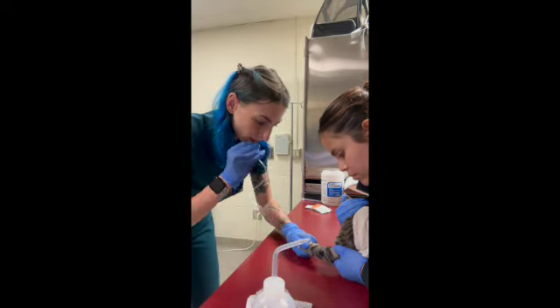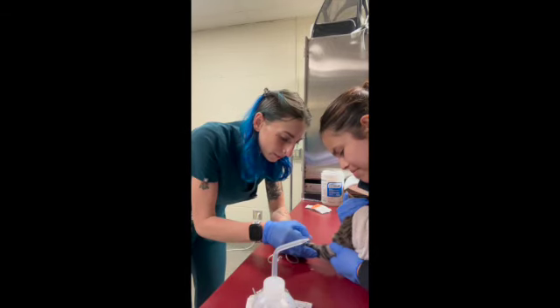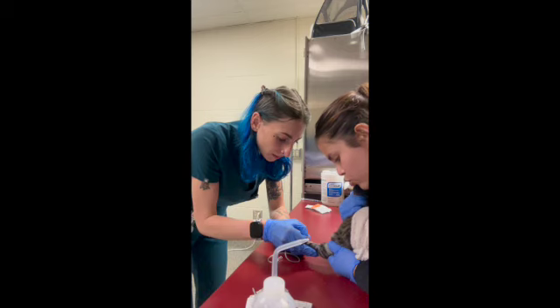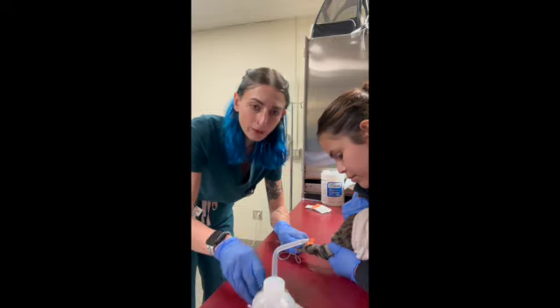Please let me get this on the first try. Probably should not have taken that out with my mouth either. All right. And now we're going to poke. Alright, so there's blood in our line now, so I'm just going to go ahead and grab my syringe here.